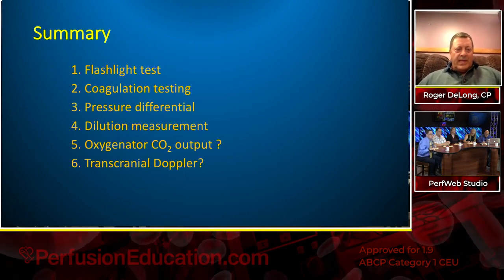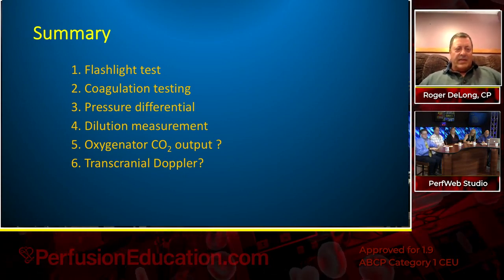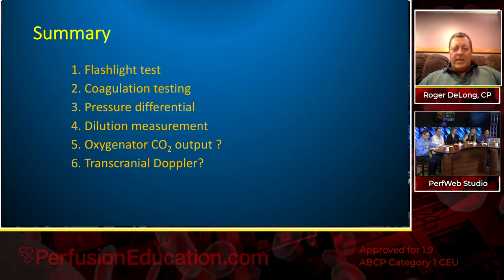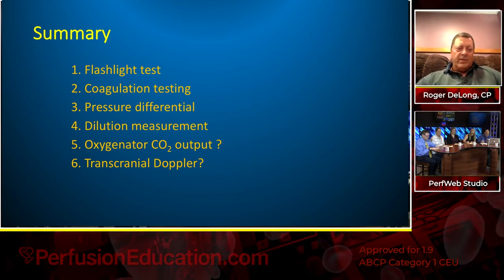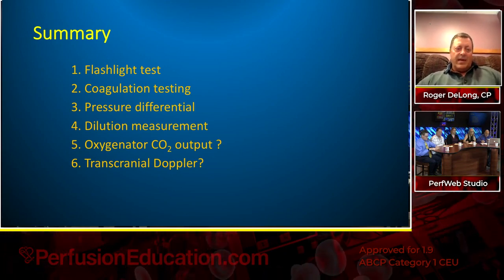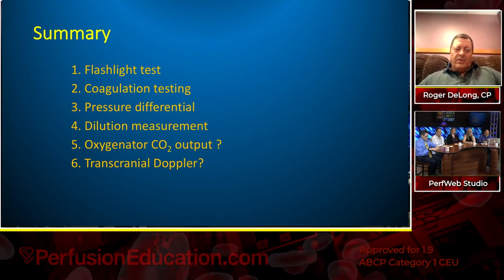So those are all the tests kind of rounded up. The flashlight test, a lot of fun to do, but not much use. The coagulation, well, that's going to continue to be used because it does give a lot of indicators for other things, but not so much for clotting. The pressure differential, so a lot.